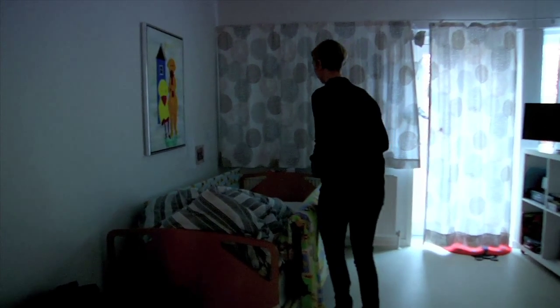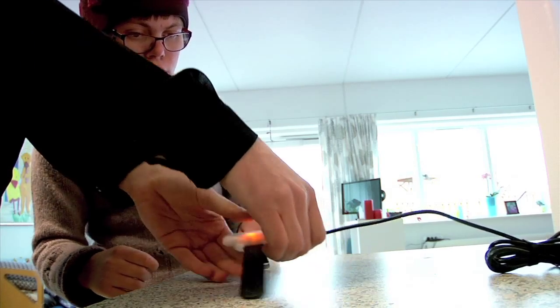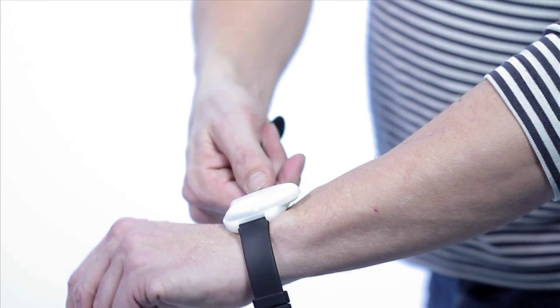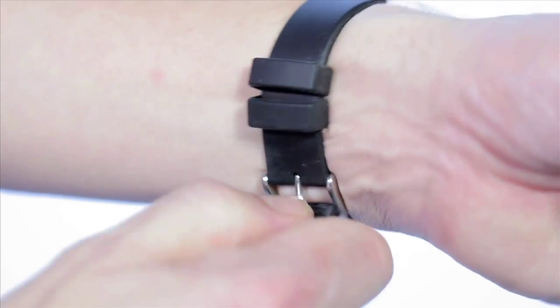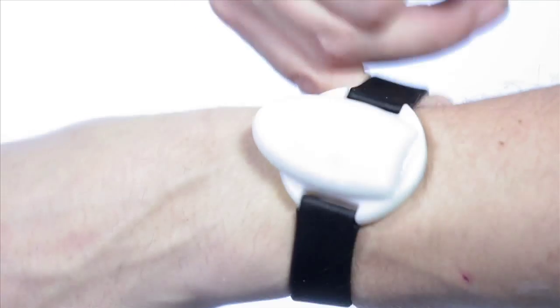The armband has a small built-in battery that must be recharged once daily. Recharging takes about one hour. It does not matter whether the sensor points forward or backward, and it can be worn on the left or right wrist, but must not be too loose.